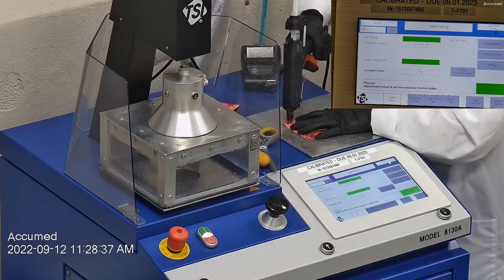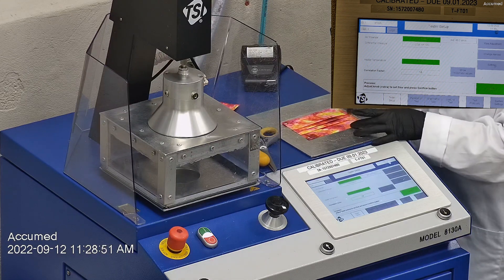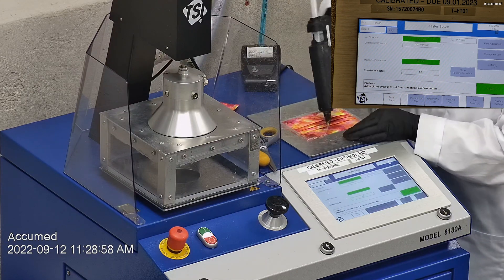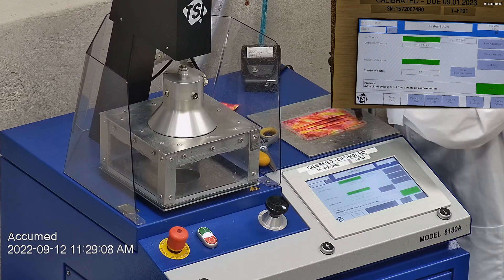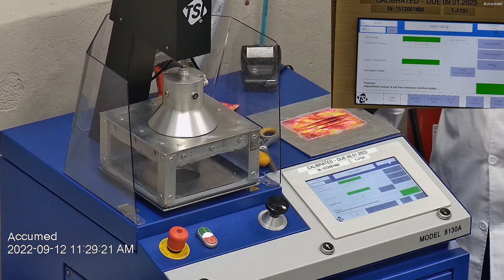We make sure that the mask is properly and completely sealed with hot glue to the testing plate. When applying the hot melt glue, we make sure that there are no holes or leakage around the seal to ensure accurate results. The testing plate is then attached to the frame and the box is placed under the TSI filter holder for testing. The results are displayed on the TSI monitor.